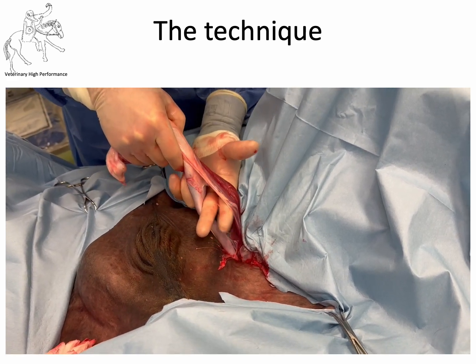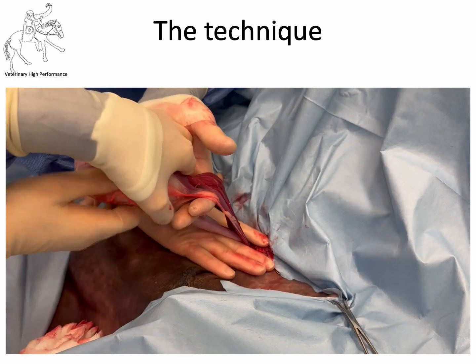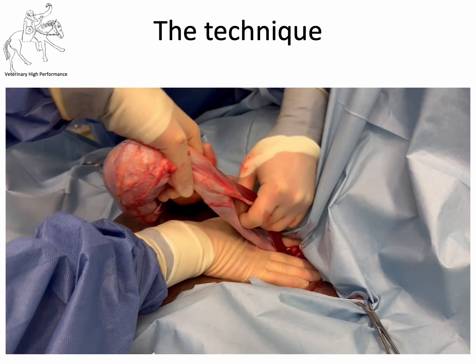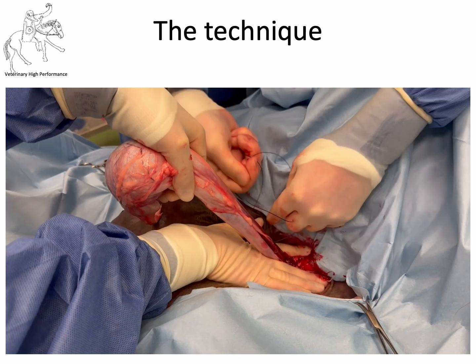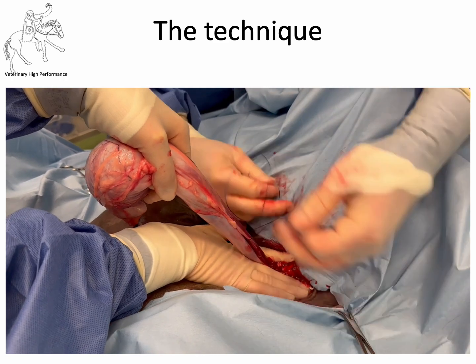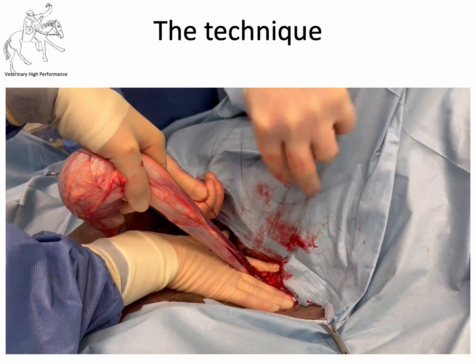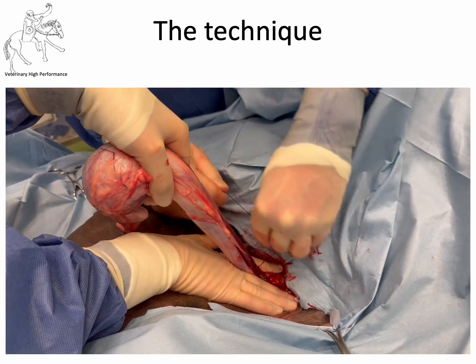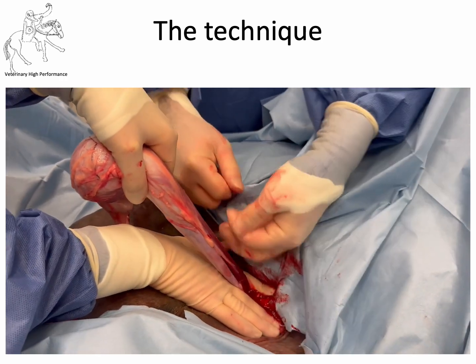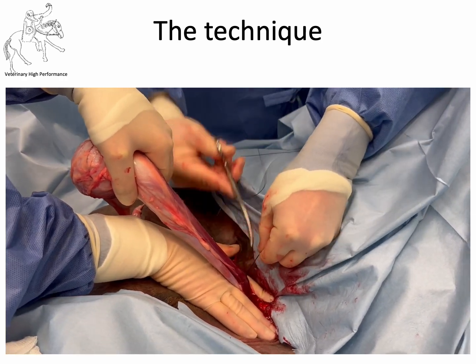The next stage is to separate the cremaster muscle — make a hole between the cremaster and the spermatic cord. It's very useful at this point to have an assistant press their fingers against the body wall while ligatures are applied. In this case, ligatures of monofilament absorbable material of around 4 metric — that's 1 USP — with a surgeon's knot. The cremaster knot doesn't need to be too tight, because the suture can tear through if over-tightened. Once placed, we cut that.